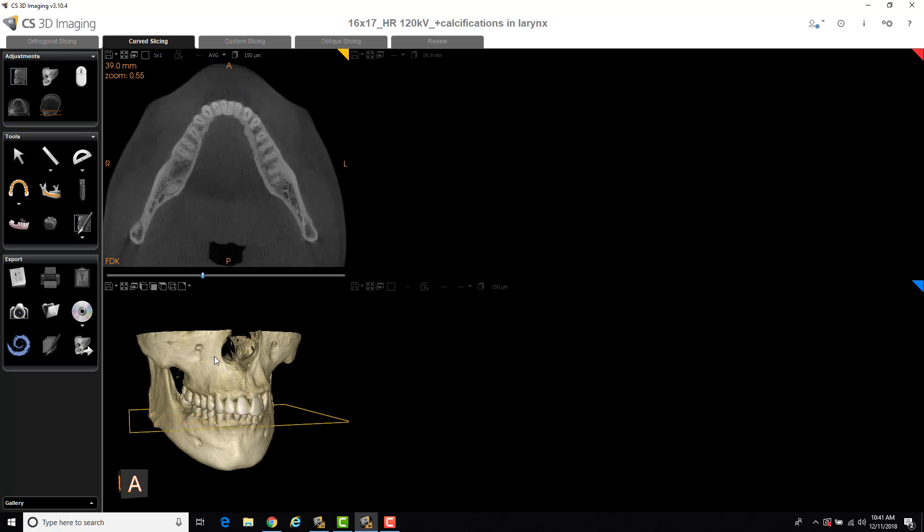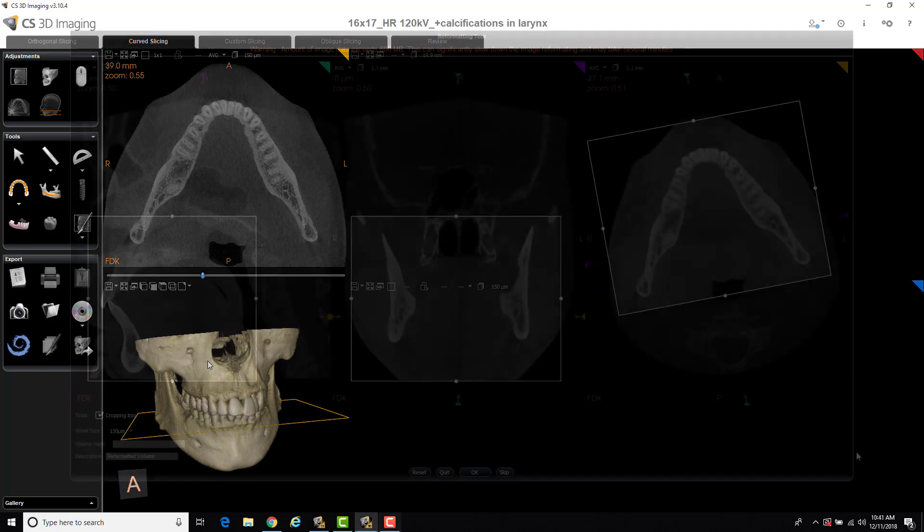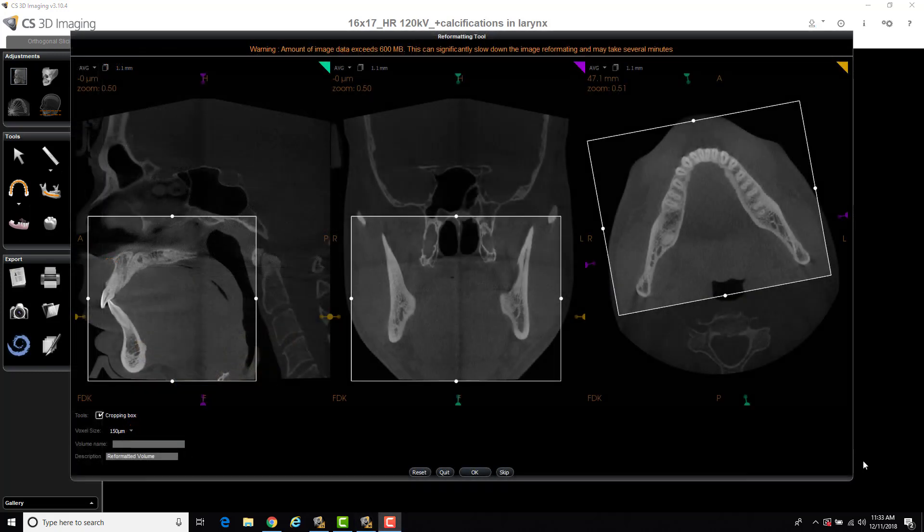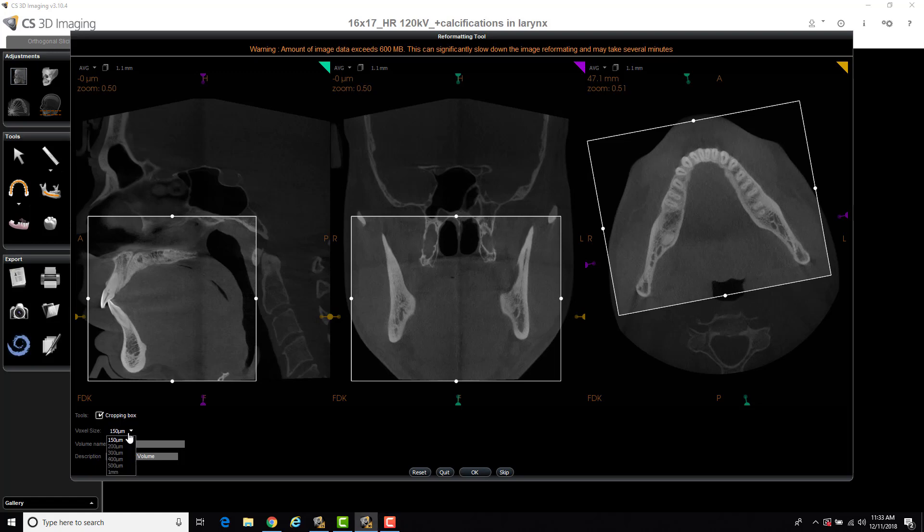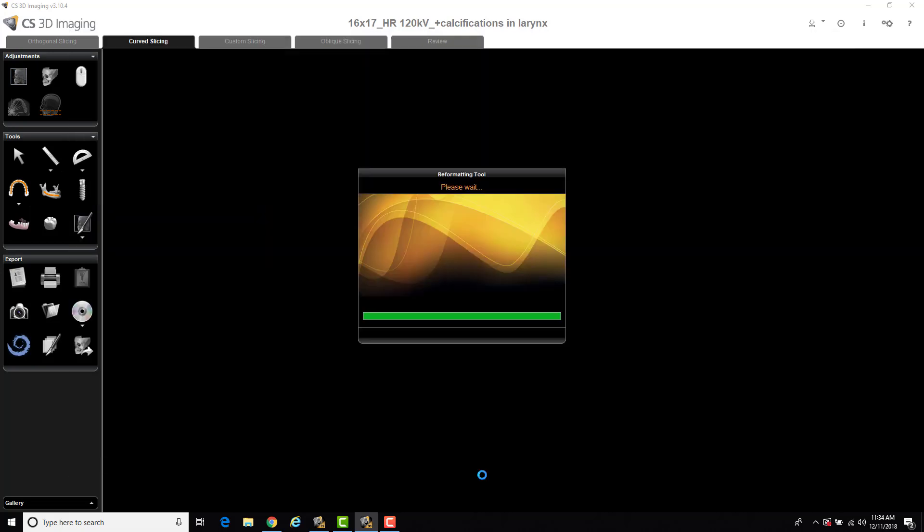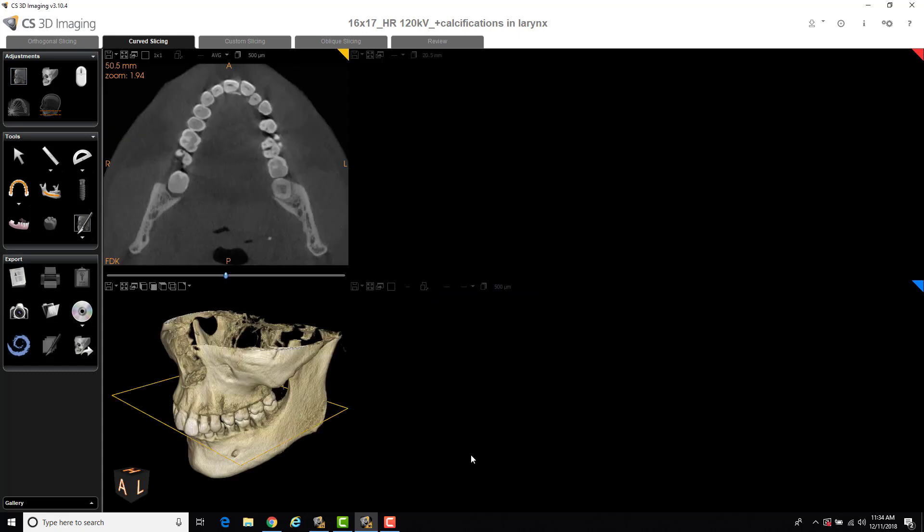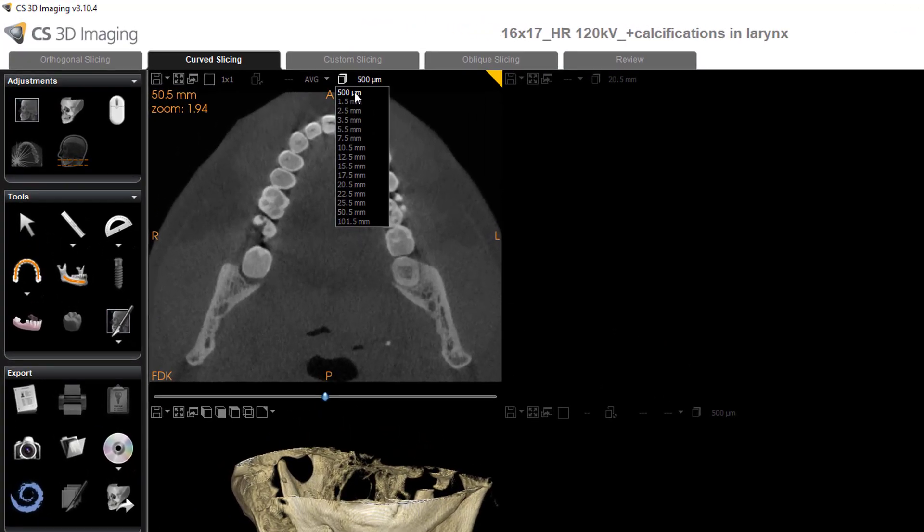And now you can work easily within the scan. So one other application of using the reformatting tool is you can dummy down the resolution from the native resolution of a 150 micron scan to, let's say, 400 microns or 500 microns. Some other planning software programs require a lower resolution. So this is a way to reformat the actual scan. I can rename it, cropped with lower res, and select OK. And again, that reconstructs the data and reformats the data. So now you can see the lowest resolution of my scan is 500 microns.